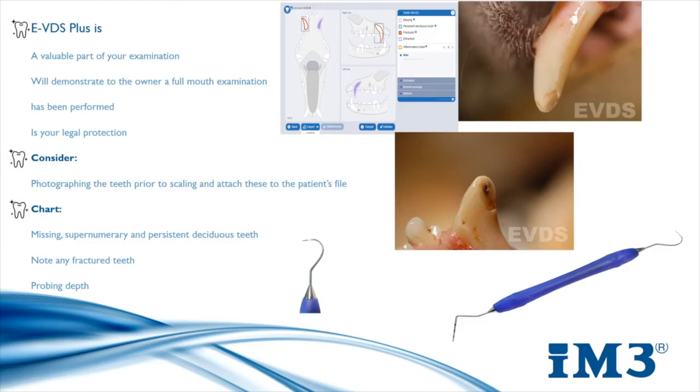We can then go on and use the probe end of the periodontal markings. These are actually etched in black on the ergoperiodontal instrument, and these are used to actually assess the probing depth of the tooth.